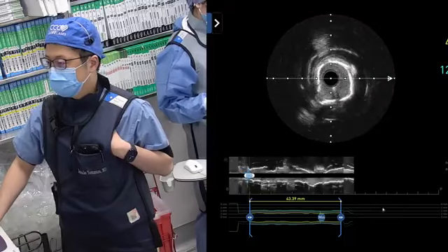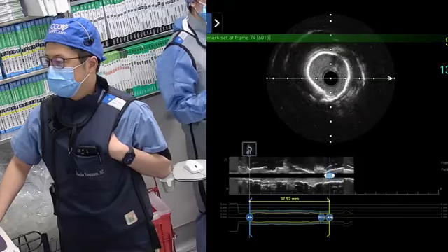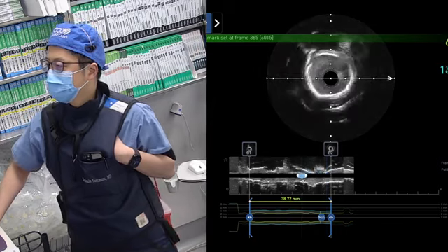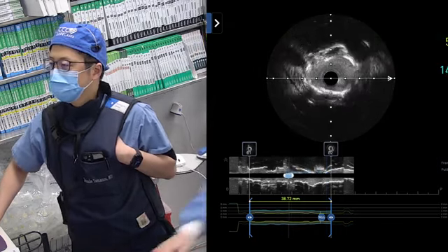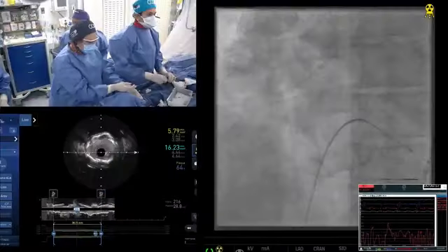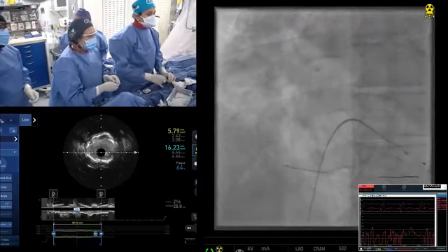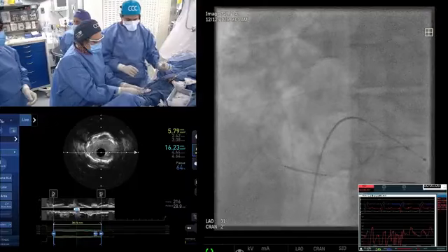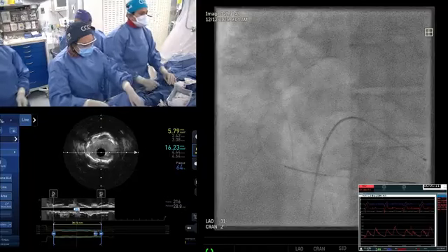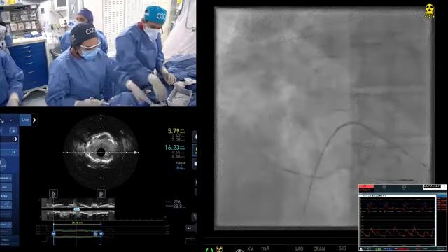As you know, many companies are combining these techniques. One is coming with OCT that has FFR in it, by Abbott. Second is Terumo, which has both OCT and IVUS. Kiski went there and they presented to Anu. Tell us what that catheter is, and why would you want to do both in one catheter? Because there are limitations of IVUS and OCT. If we have one catheter with both imaging modalities, they complement each other. Calcium thickness OCT can tell, but deep penetration and sizing IVUS can tell. So one catheter will do both. Yes, that's the Terumo OCT-IVUS.